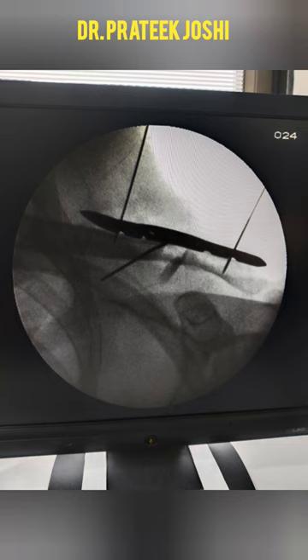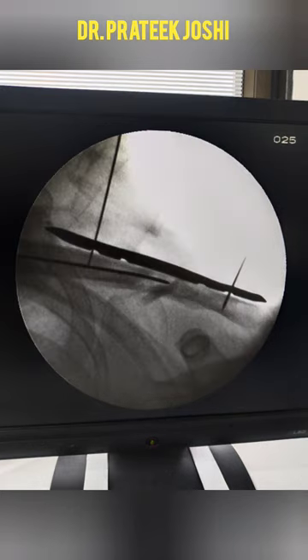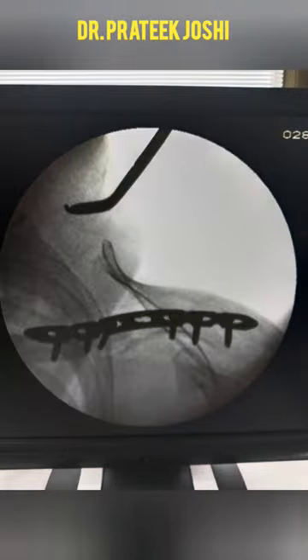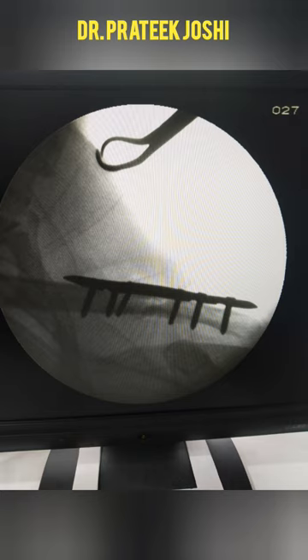We confirm the plate position, then complete the final fixation and insert all the screws. In this case, there was comminution and a separate butterfly fragment, which we stabilized with the help of number one Vicryl.